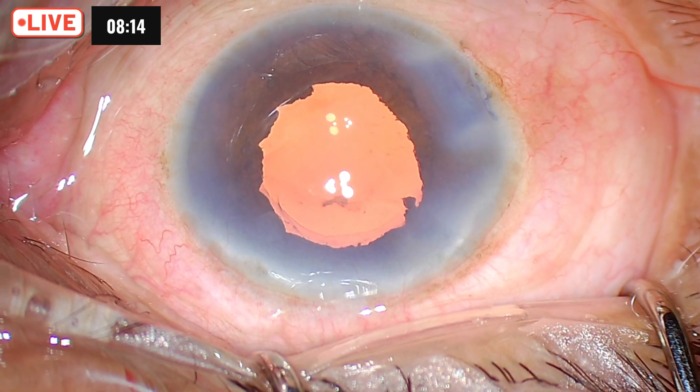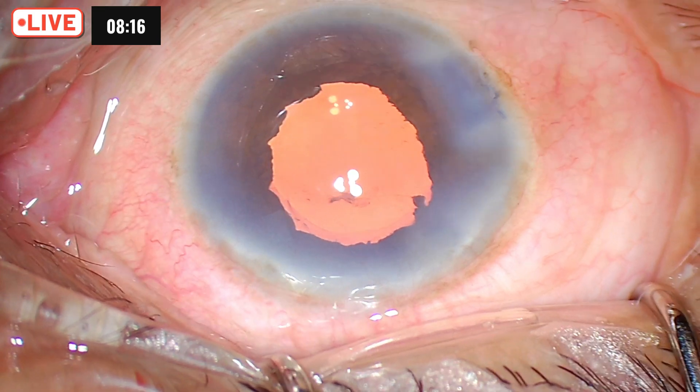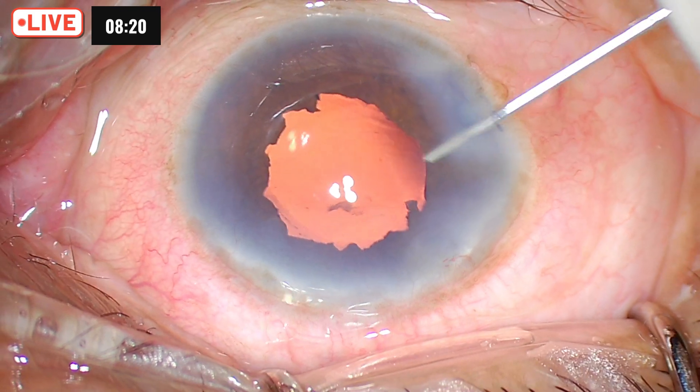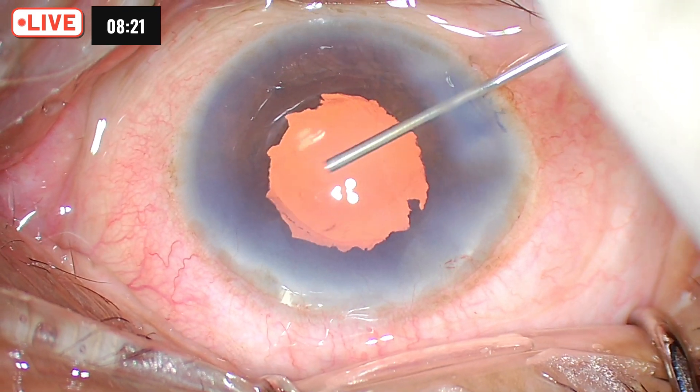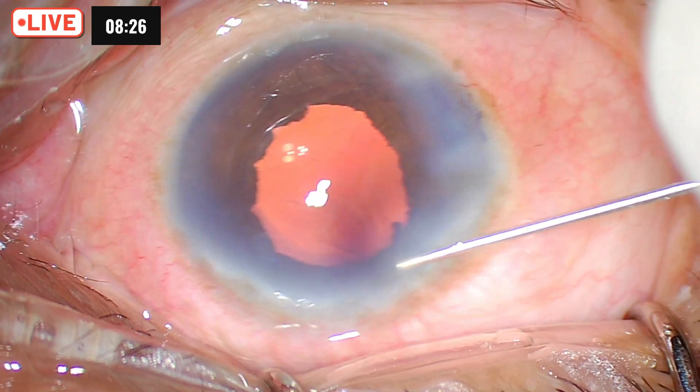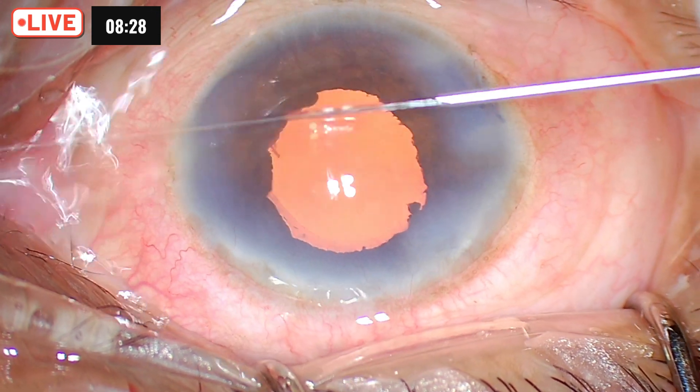There seems to be some amount of viscoelastic or maybe some cortical matter behind the IOL. We will try and wash that away. There we are in business — the patient has done very well.